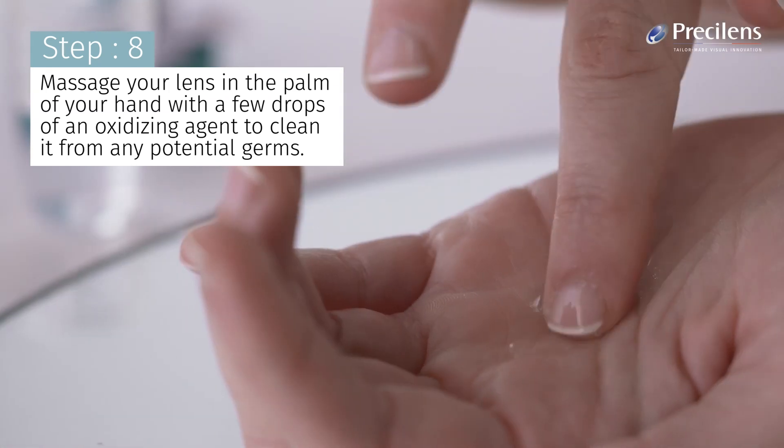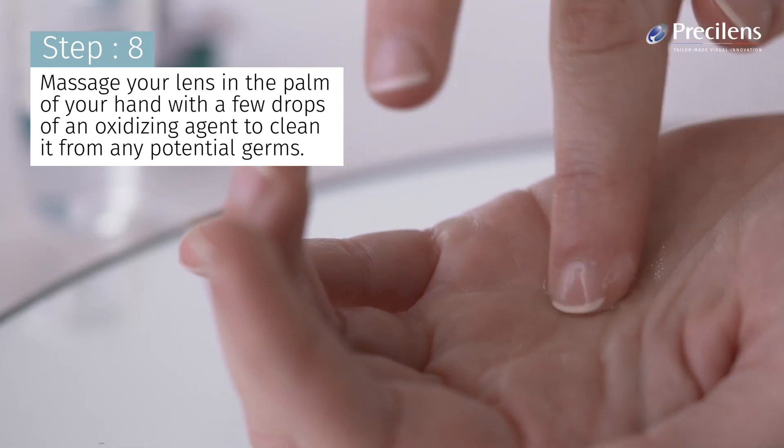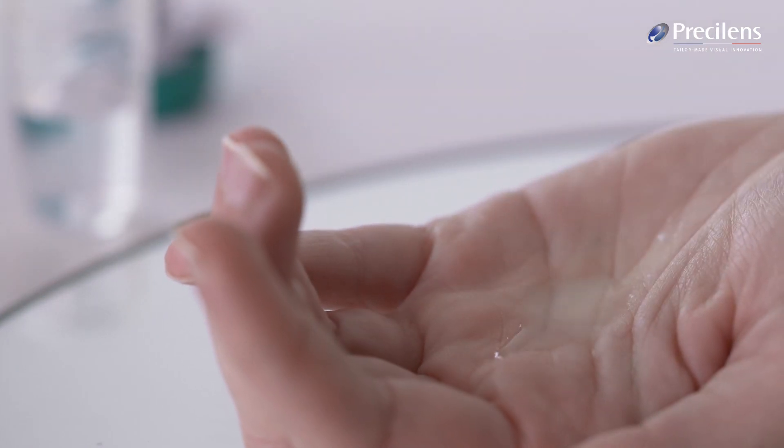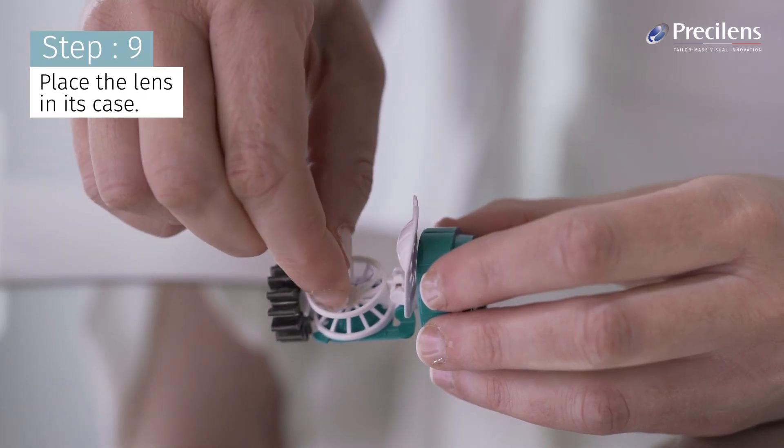Massage your lens in the palm of your hand with a few drops of an oxidizing agent to clean it from any potential germs. Place the lens in its case.